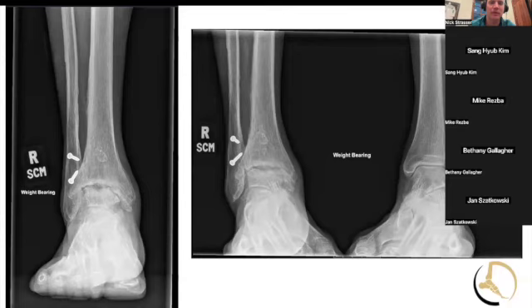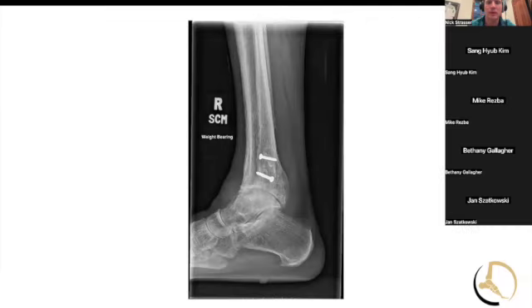I'm not really sure, I don't know if I have a good rationale. I think it's because I didn't want to go through the lateral skin that I didn't go after those. And I took out the posterior hardware and did a little bit of an anterior cheilectomy, took a biopsy from the joint, just to get rid of the hardware there, thinking that if everything healed up okay, maybe I'd offer her a total.